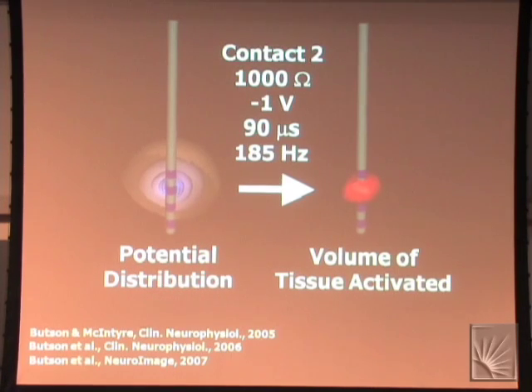That's what's called a monopolar review, and it is usually used that first visit when the patient comes back after their surgery. The idea is to find the right contact. So you're looking for the contact that had therapeutic benefit at the lowest voltage and had the largest window before you got to a side effect.